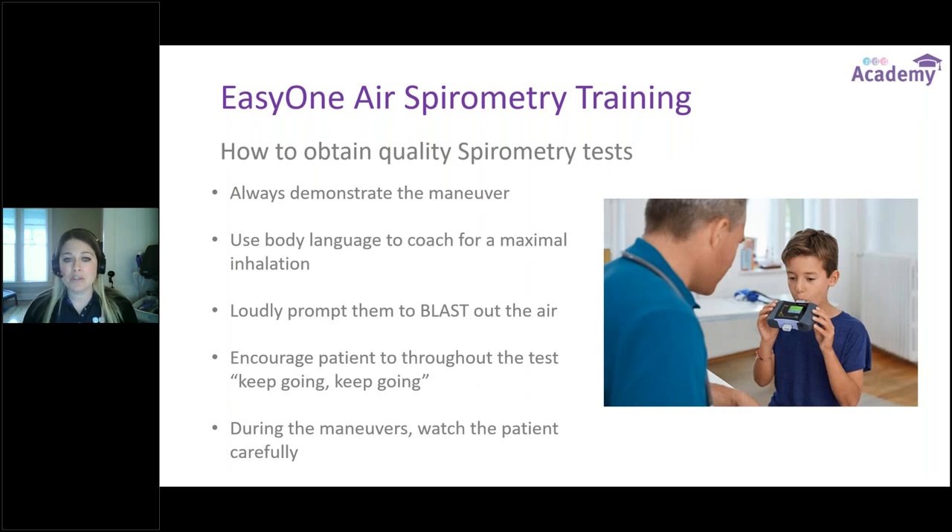To obtain good spirometry tests, always demonstrate the maneuver. I tell offices to keep their own flow tube as a practitioner — keep it in their pocket — so they can show how to make a good tight seal and demonstrate the test before the spirometer is ever in the patient's hands. Use body language for maximal inhalation, then loudly prompt them to blast out. Be really animated and show them exactly what's expected. Encourage the patient throughout the test and watch carefully for errors.